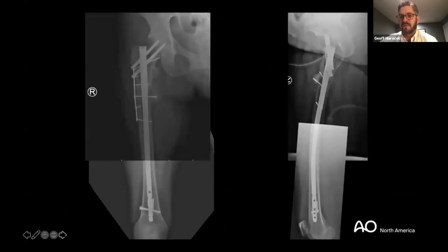And here's the end result of a fracture that was loaded with this articulated tensioning device and this lateral fracture to bring it out of varus, and was corrected in the sagittal plane as well, and getting a new start point. So we're kind of up for time, but I really want to highlight the importance of getting the correct start point and the correct trajectory in the proximal segment.